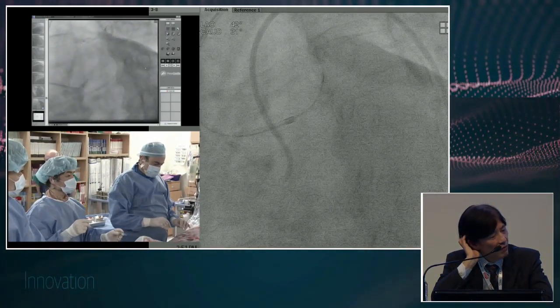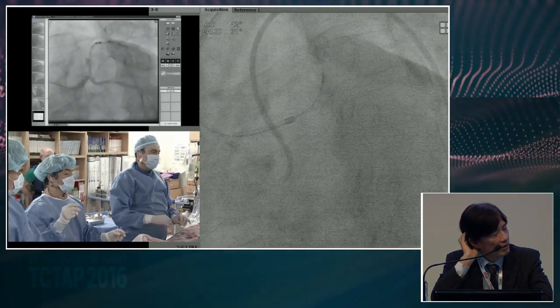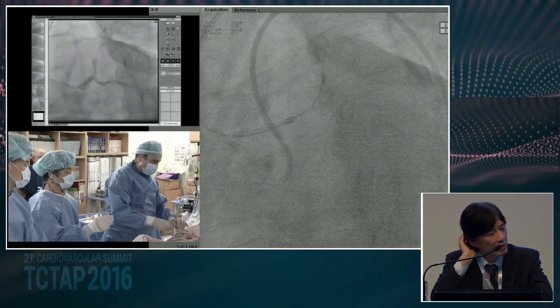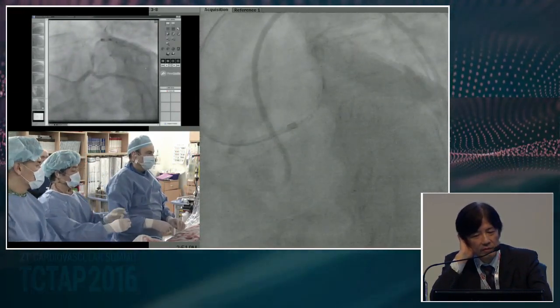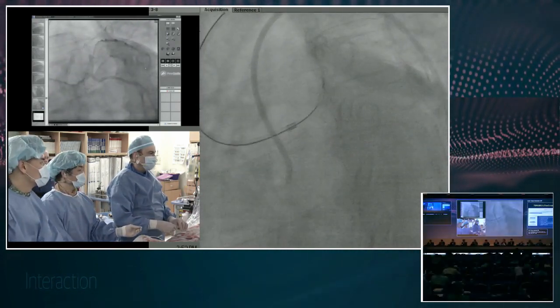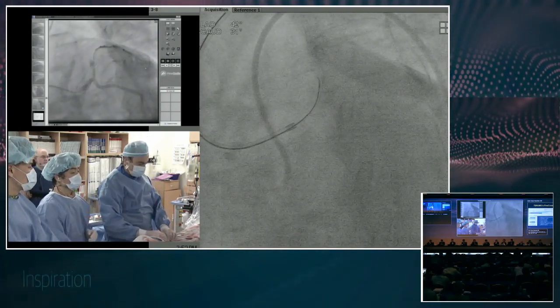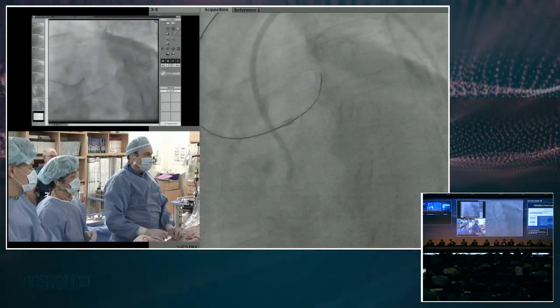Profile in CTO. The smaller one is a Fine Cross. Yeah, Fine Cross, but I don't think I'm going to have the support with the Fine Cross. And I don't want to put a GuideLiner in there just because of the reason we discussed. So what is your first wire choice? What kind of wire would you choose? This is a Gaia 2.